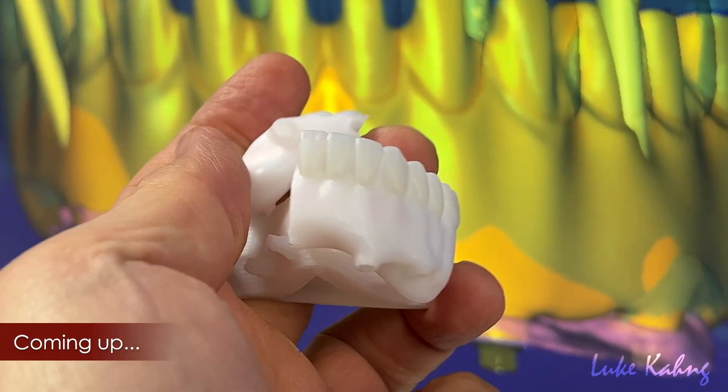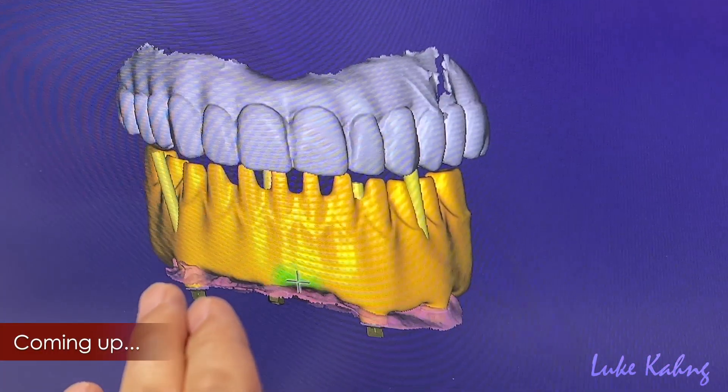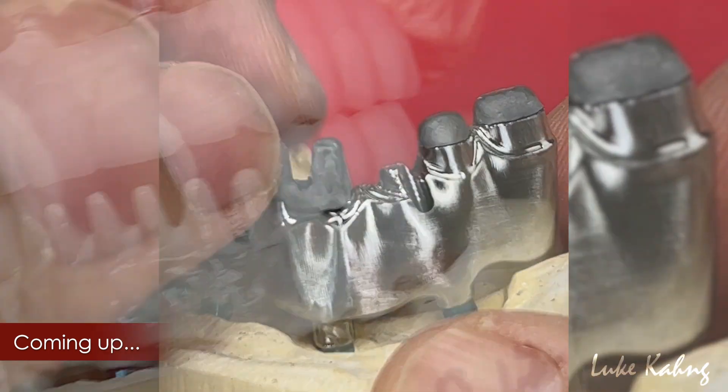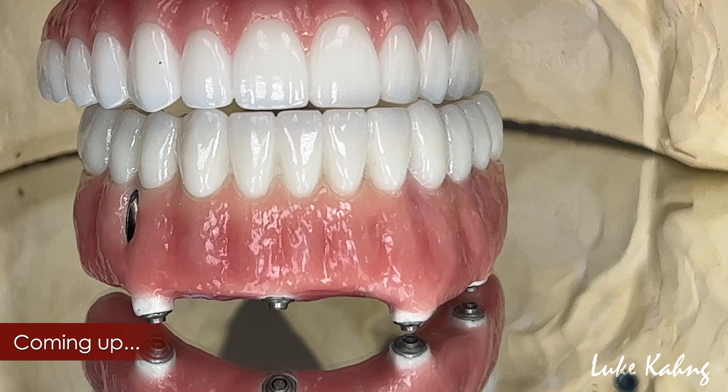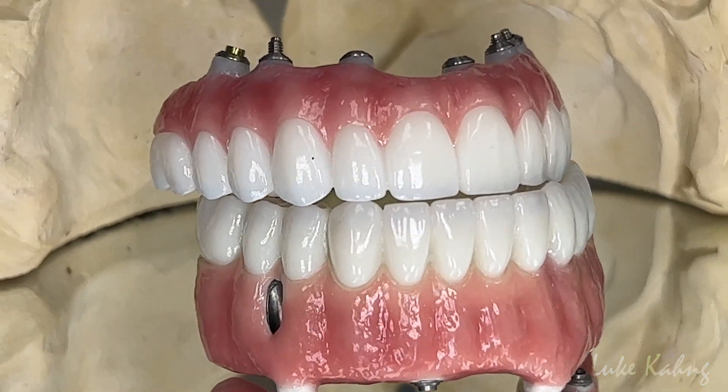This is the most tough case, which is the four implants, over 35mm — almost 35mm. The milling problem: cannot mill, and then access holes issue. I'm going to decrease this much.